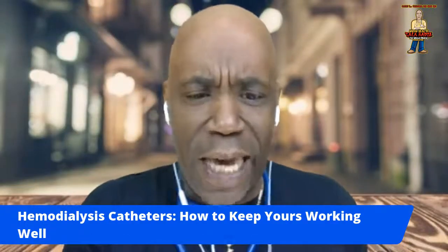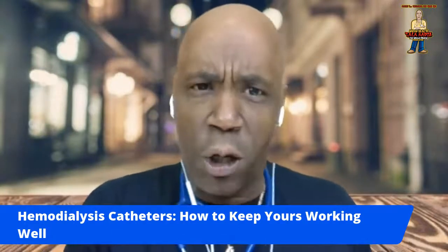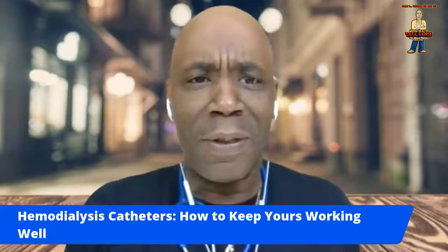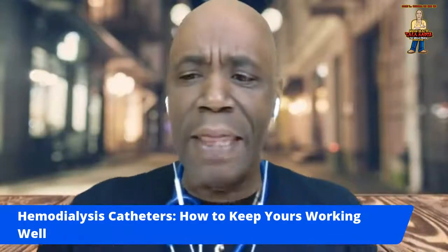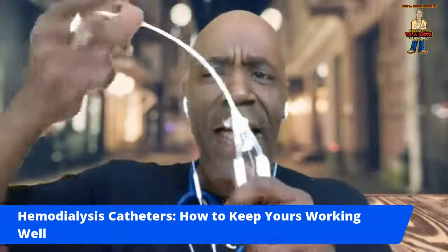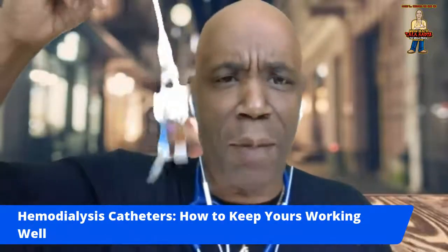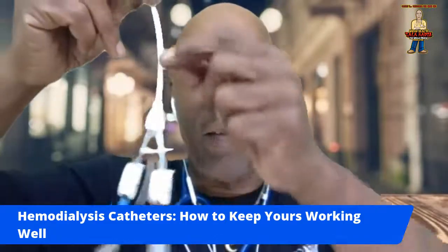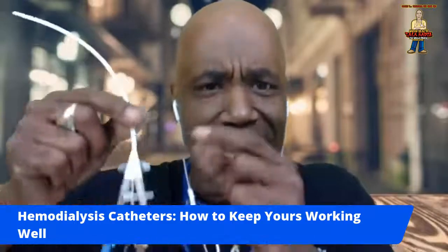By taking good care of your access, it will last longer and you will prevent problems such as infections and clotting. Let me tell you, infection and clotting are the two major complications that come from this. Especially when you have a clot in this line right here, we have to put a medication in.